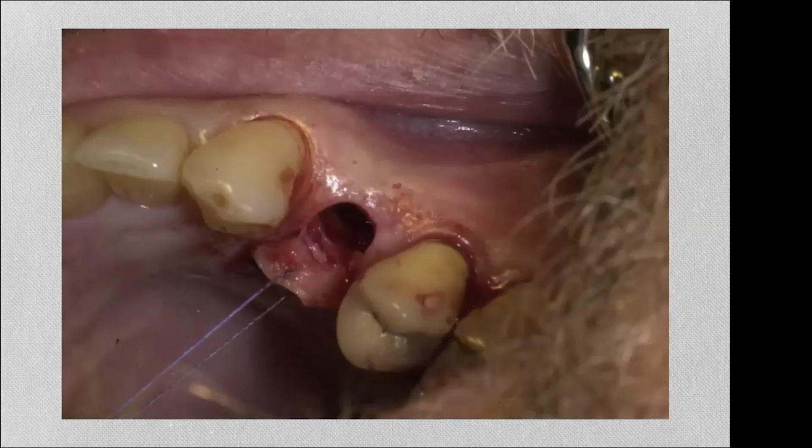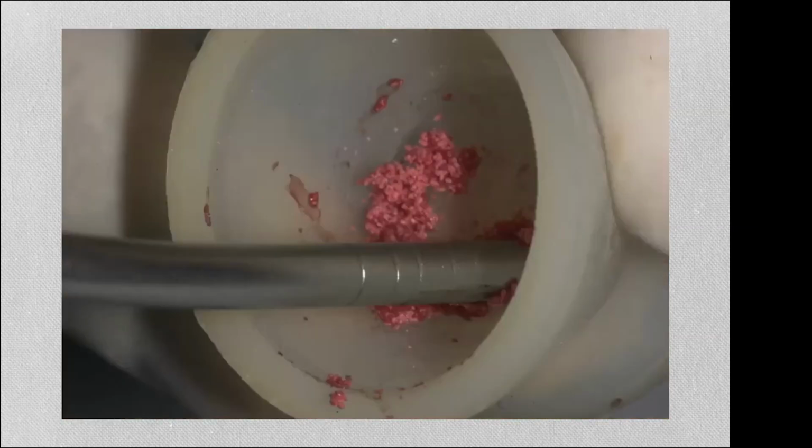And then now, instead of having a bony floor to our osteotomy, we have a hole in the bone and yet no hole in the soft tissue. Okay, you can verify that with a curette. We take the SynthoGraft. In this case, I mix the SynthoGraft with the bone. Okay, if you want to do that, expect it to be a little bit drier. And don't overmix it, because the mixing can kill all of these viable cells in the bone.